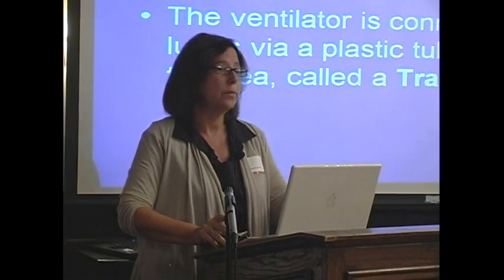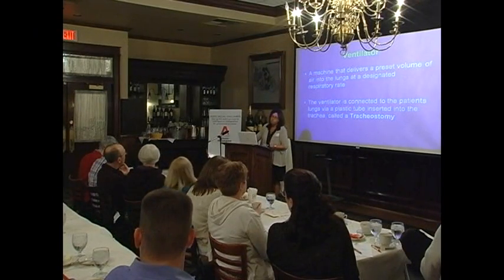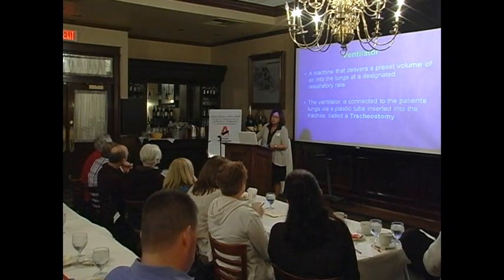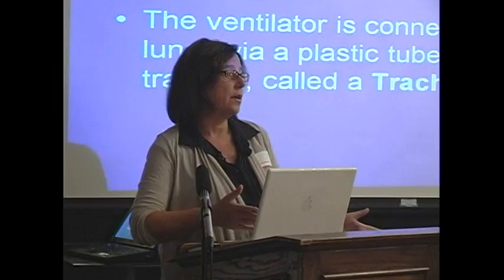It's there to help. Yes? By the same token, is it of any benefit to start on a BiPAP sooner than what insurance might cover at that sort of 50-some%? That's a good question too. I'm sorry. The question was, is there any benefit in starting it sooner?